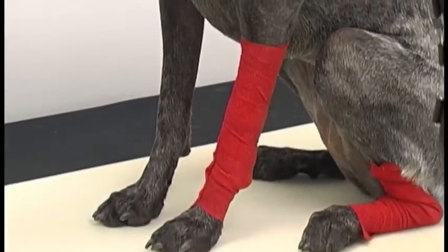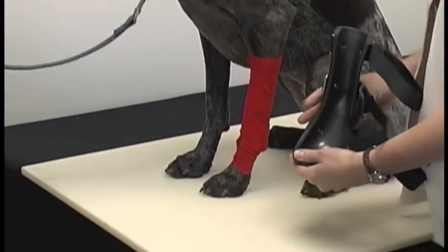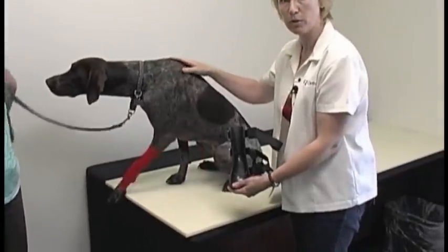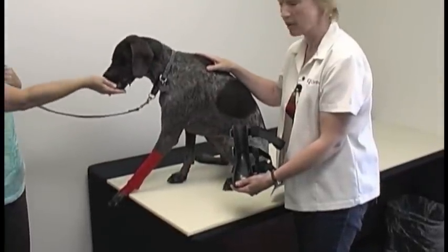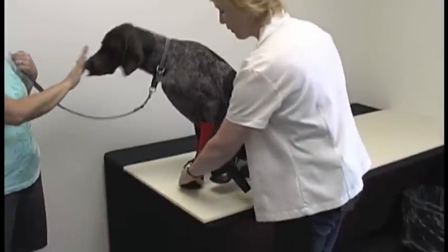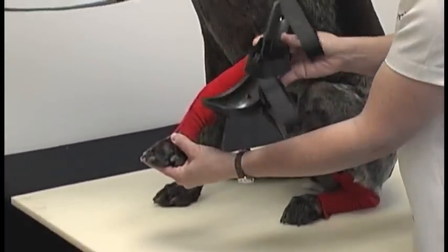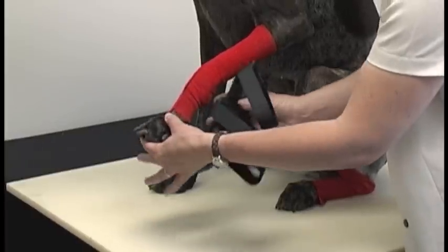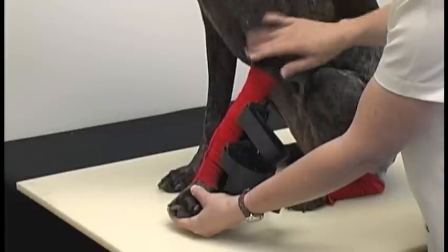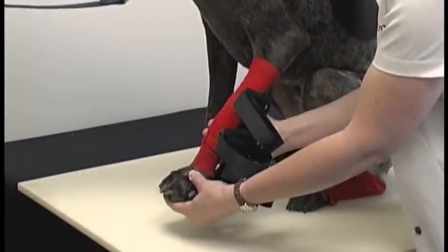This is our model today. She's being a good dog, and we're going to place this on her front leg. You can do either sitting or laying when you do a fitting for the front limb. Today we're going to do a sitting version. We like to have the animal's limb positioned in a normal position because you're going to slip the splint on. What I normally do is get the dog to kind of relax her shoulder and distract with treats — that works really well.